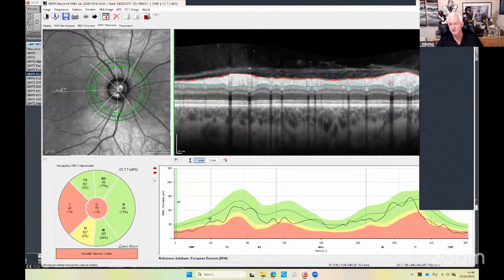So when you see temporal loss, just be aware that could be related to neurodegeneration or thinning because of glaucoma, but equally it might relate to a non-glaucomatous problem, because we see nasal temporal changes in cases like MS, for example, rather than inferior superior changes that we see in our glaucoma patients. So little yellow flags go off in my head when I see these temporal areas to start with.